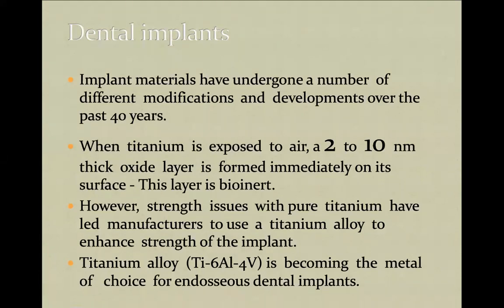Well, what I'm doing in my practice, I've just tried and I found something in between. It's a balance of quality and price. For the last 3 or 4 years, I'm using South Korean production. It's very nice. I really like their design and the post-operative results. And up to now, I think the number of implants that actually failed was 10, not more, over a 3-year period of time.